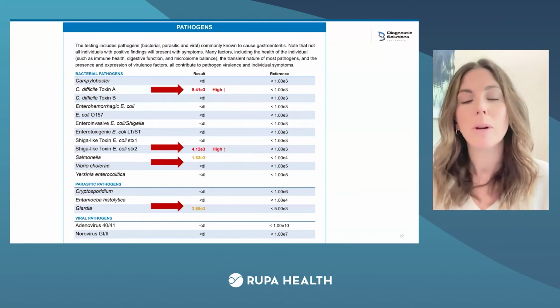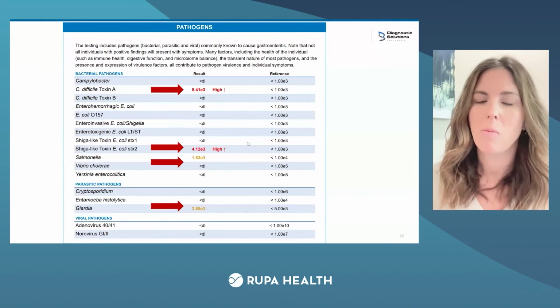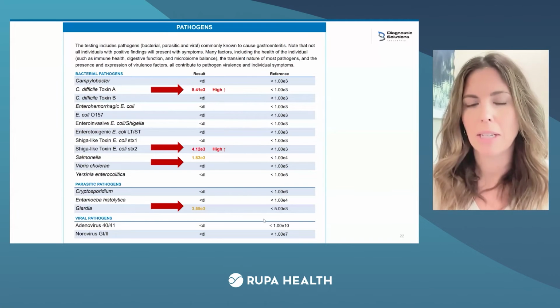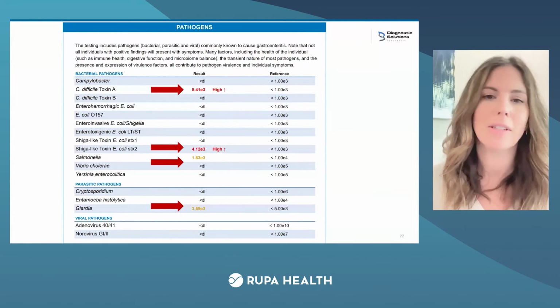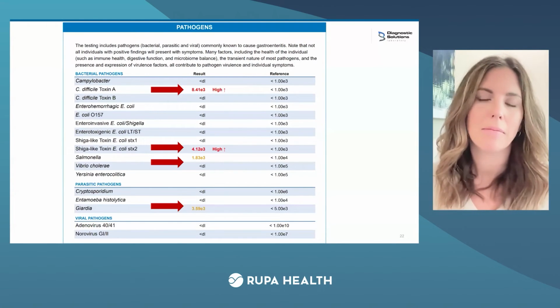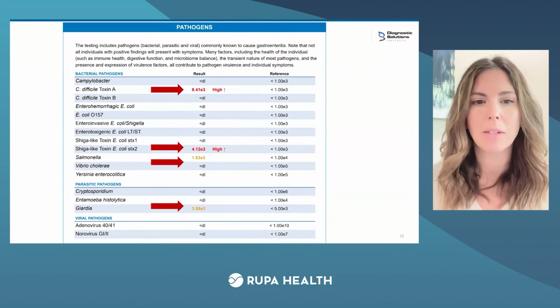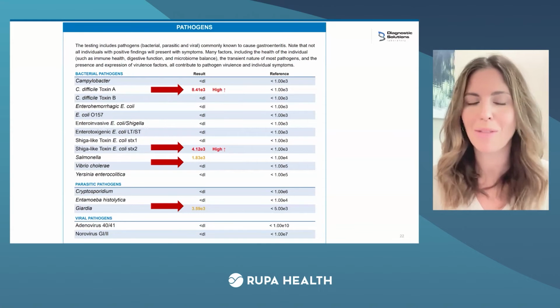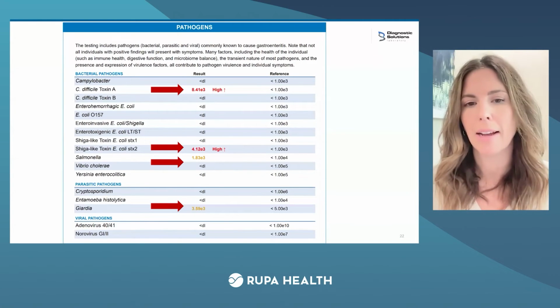Whereas at E3, we've got what would be considered an asymptomatic carrier status, even though this child has symptoms. But C. diff at low levels can still be problematic. You can have damage to the gut lining. You can have GI symptoms. You can have some anxiety sometimes. And then we also see a gene for one of our nastier E. coli genes that can produce toxin at higher levels.